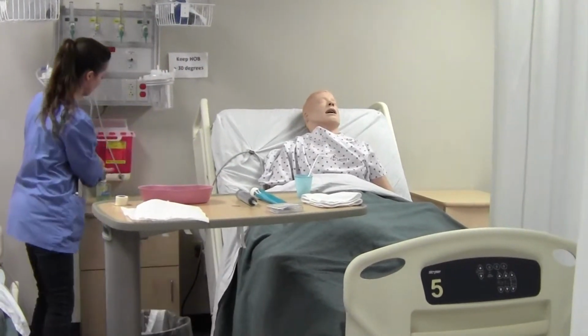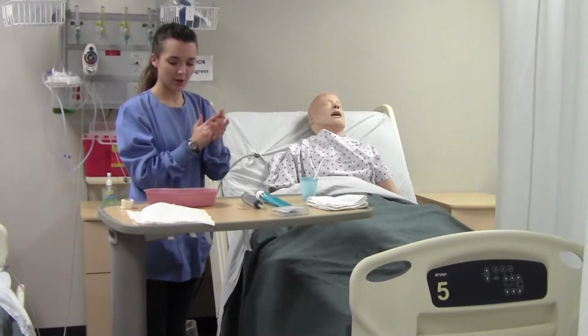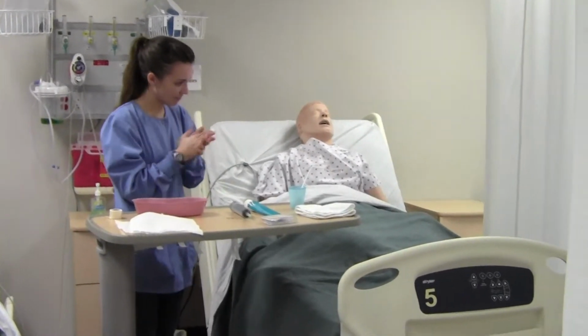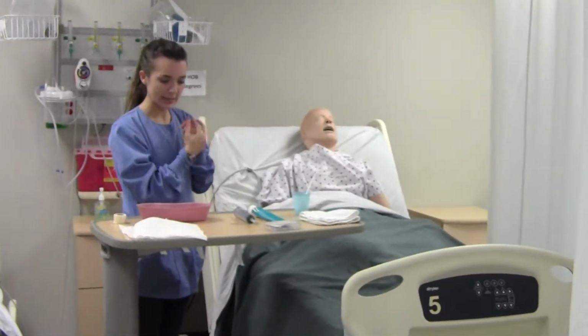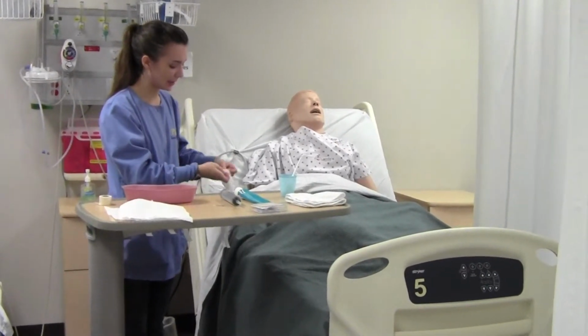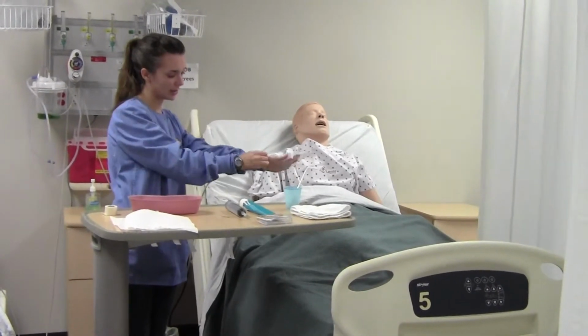I'm going to wash my hands real quick. No, you understand fully what's going on? Okay, so what I'm going to do is we're going to put these gloves on, wash my hands, and this is a clean procedure, so we don't have to worry about sterility, but we do have to keep things clean.